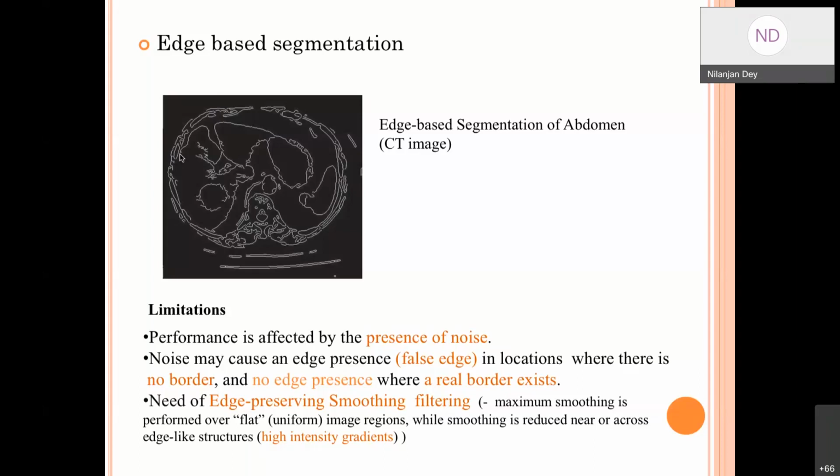The last category is called region based segmentation. In region based segmentation, you have an image and you try to find some seed points, then you grow those seed points based on the gray value, and if these values are compact, it will give you one big chunk of pixels. This is called region growing. Or the other way, you can do region splitting, where you split based on the gray value.